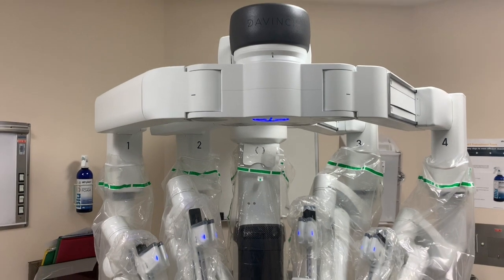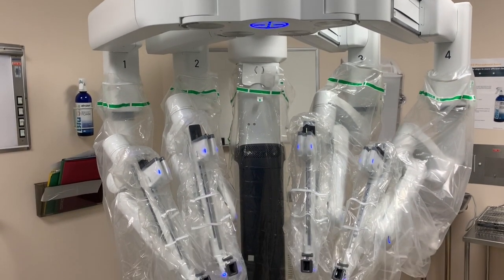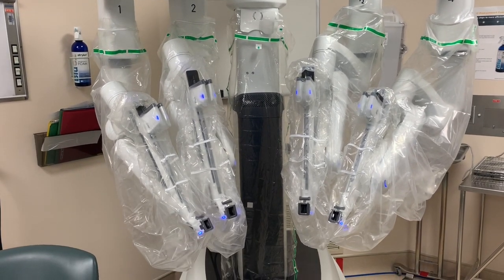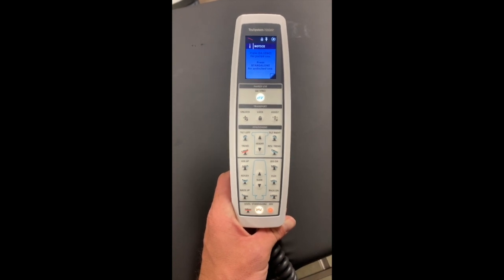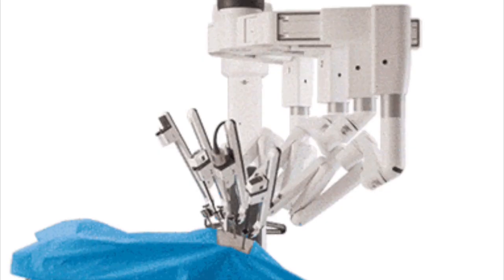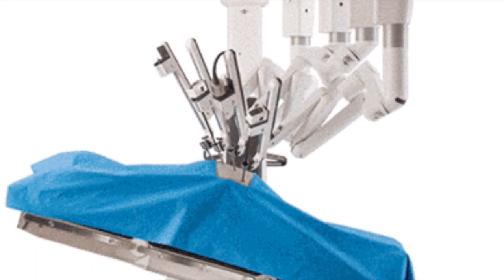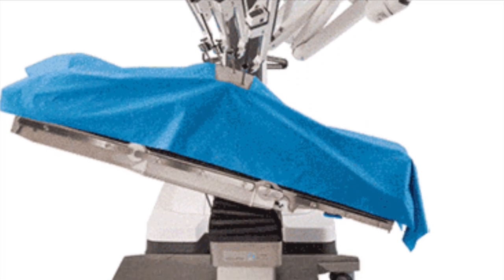If these criteria aren't met before or during ITM, the motion either will not start in the first place or it will discontinue motion if it has already started. Once confirmed the criteria for ITM has been met, anesthesia will proceed to press the DV button at the top of the hand control. The robot should respond with an audible confirmation of table motion activation once the button is pressed, and the anesthesia provider can begin to move the table in any articulation to reposition the patient.